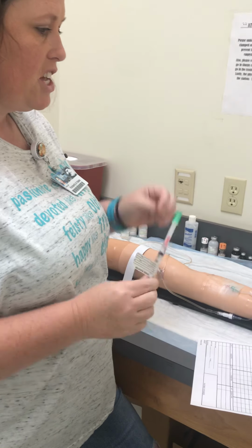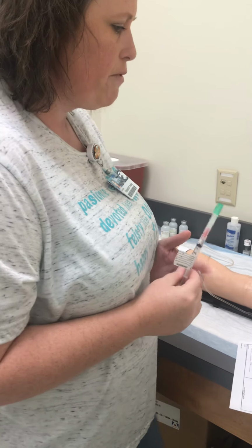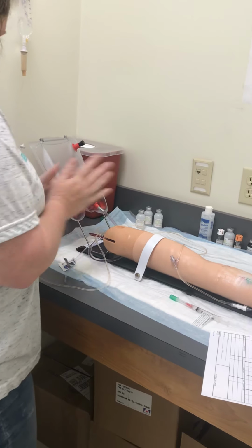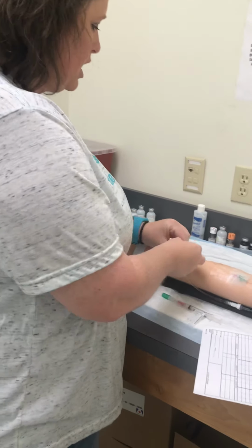I'm going to give this over 4 to 5 minutes. I'm going to give 0.1 for 4 to 5 minutes. And I'm going to wash my hands. And then I'm going to clean the port that is closest to my patient.